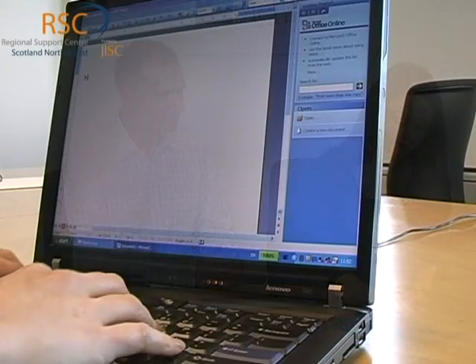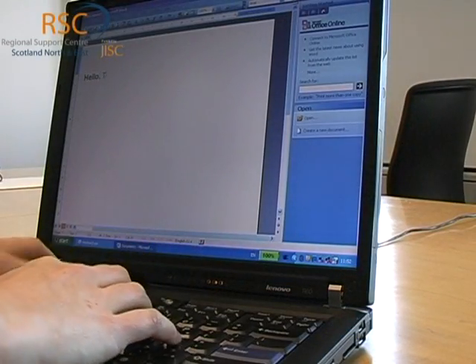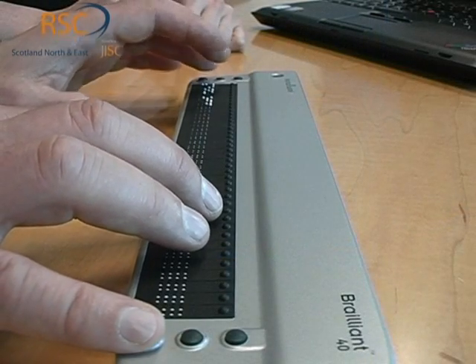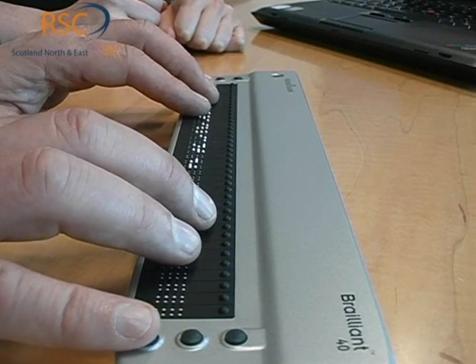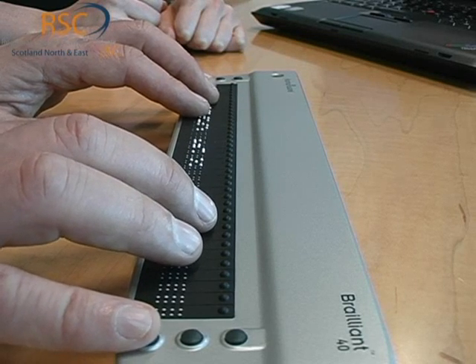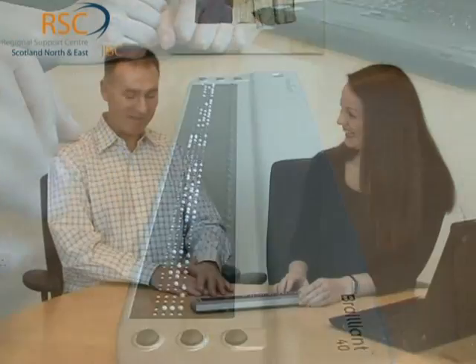So if I type into that — it's just written 'this is a test', very original. You can see on the Braille display that the text is coming up. As you're typing, the refreshable Braille display moves and the words come up on there. If it's a longer document that you're reading through, you use the buttons down the sides to navigate and read through the whole document.